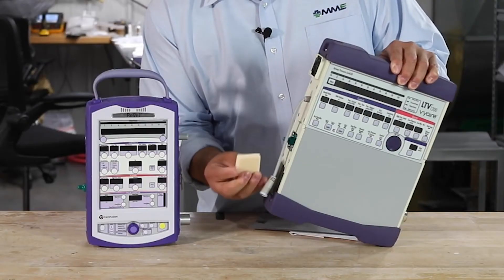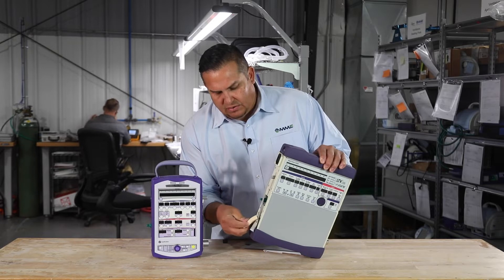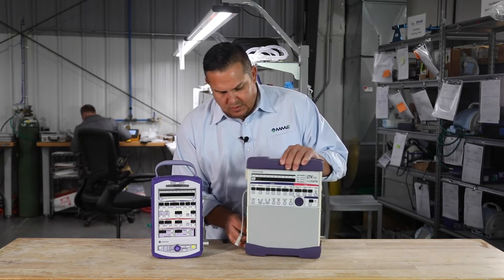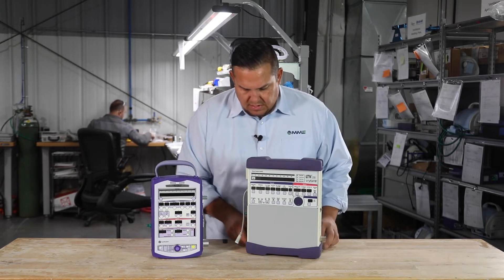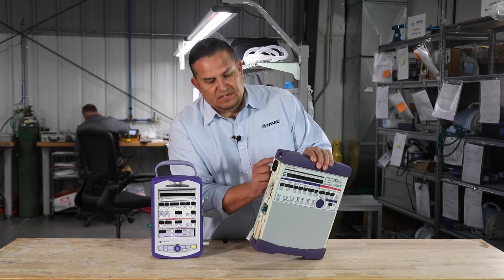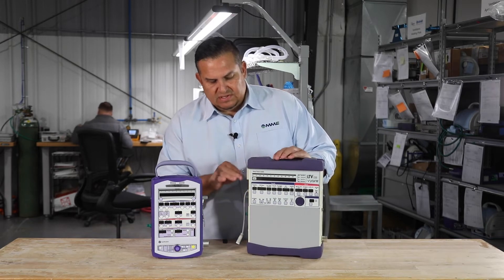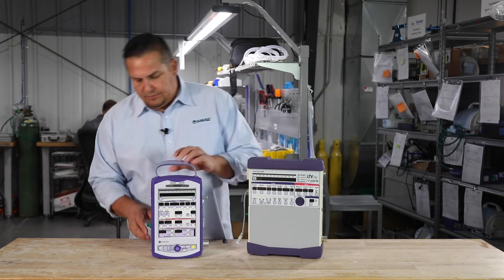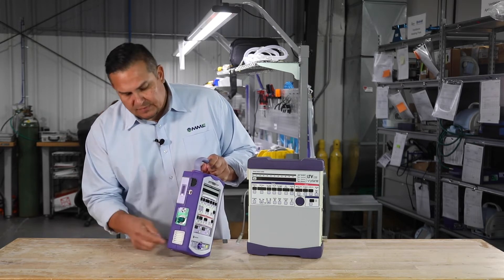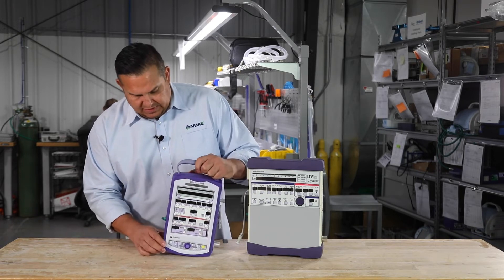Over time that filter will stiffen up and won't be as pliable, and when it stiffens up it'll have to be changed. This fan filter up here protects the computer board that sits inside the LTV — that one will just have to be dusted off and wiped off. On the ReVel PTV that won't have to be wiped off. Same for this one: as the color changes from white to a darker color, it will have to be cleaned off.